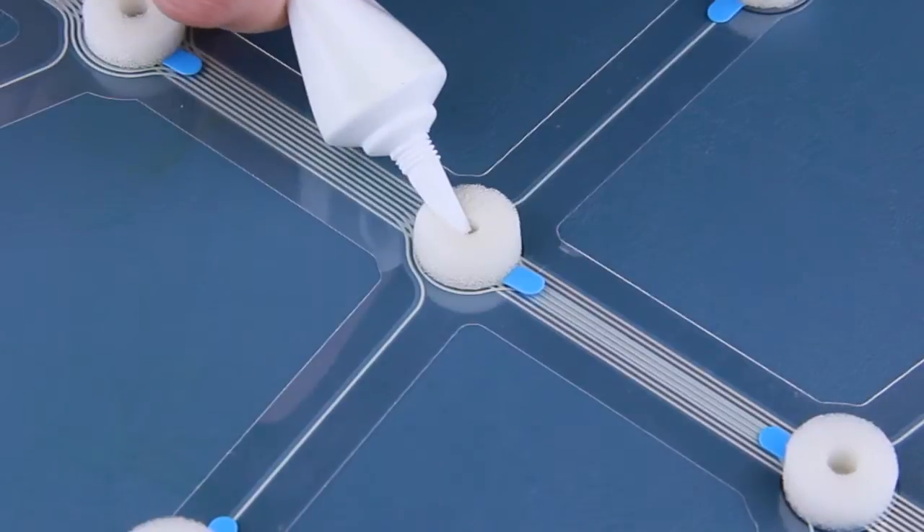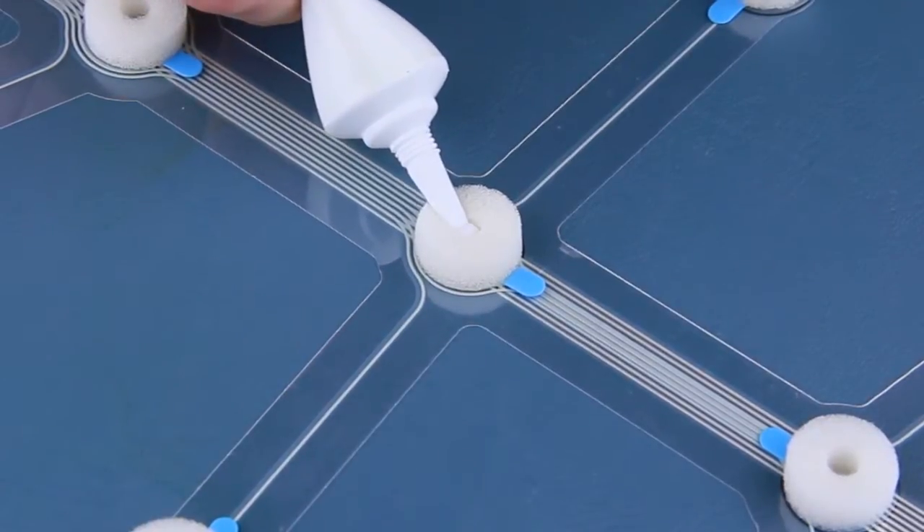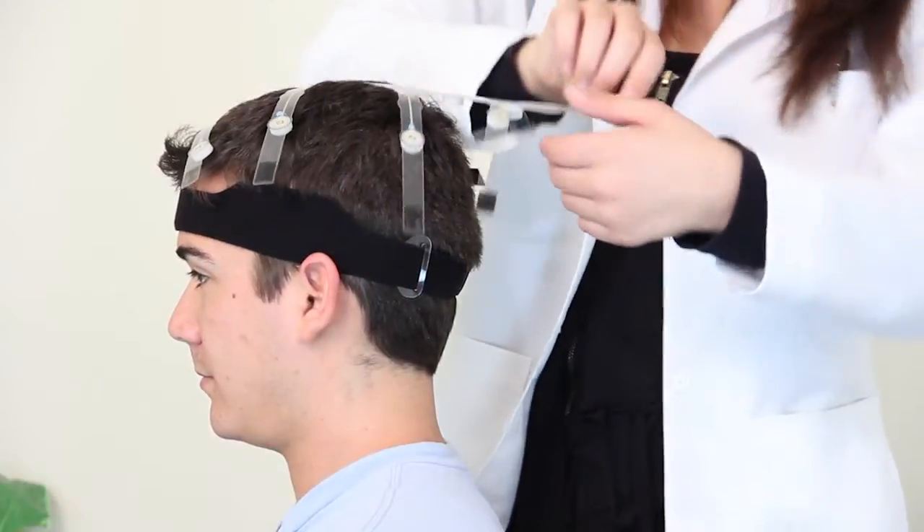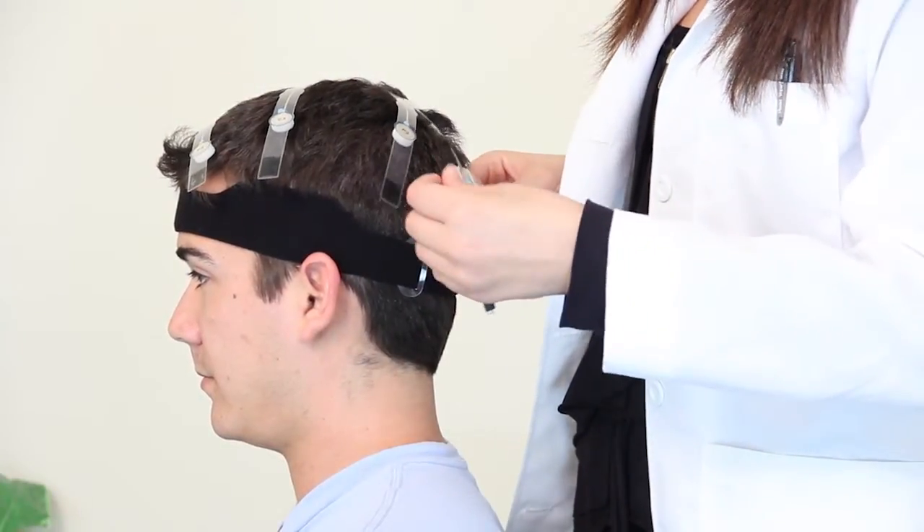A dab of conductive cream helps ensure dependable, high-quality signals across sites. The headset then applies quickly, with all sensor sites making contact at essentially the same time, and final custom fitting for extended comfort.